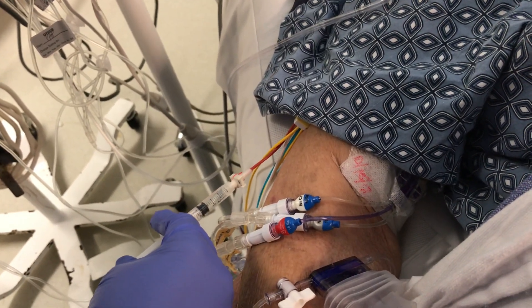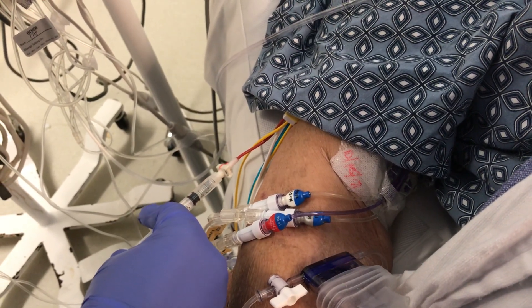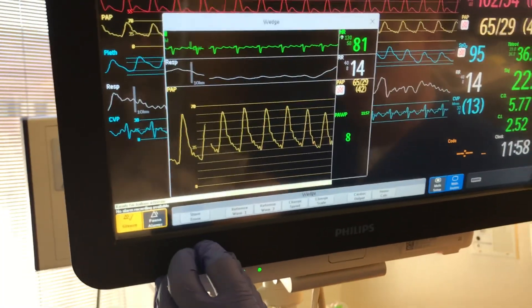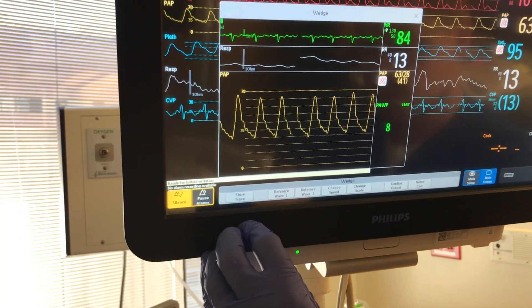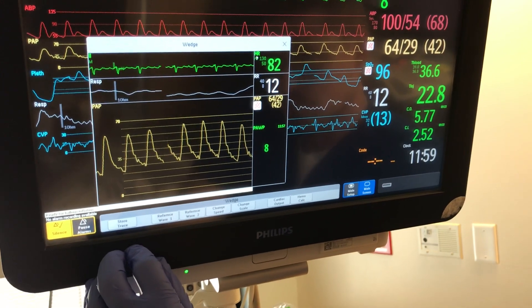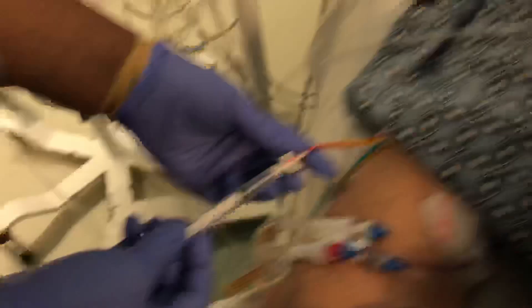Once we get a wedge that's fully on, then I'll try to get the screen right here. So you're watching him when you — exhalation. Yeah, and exhalation. And you can really do the balloon up pretty quick. So now you can see his expirations and his inspirations. So you bring the cursor in the middle of this.